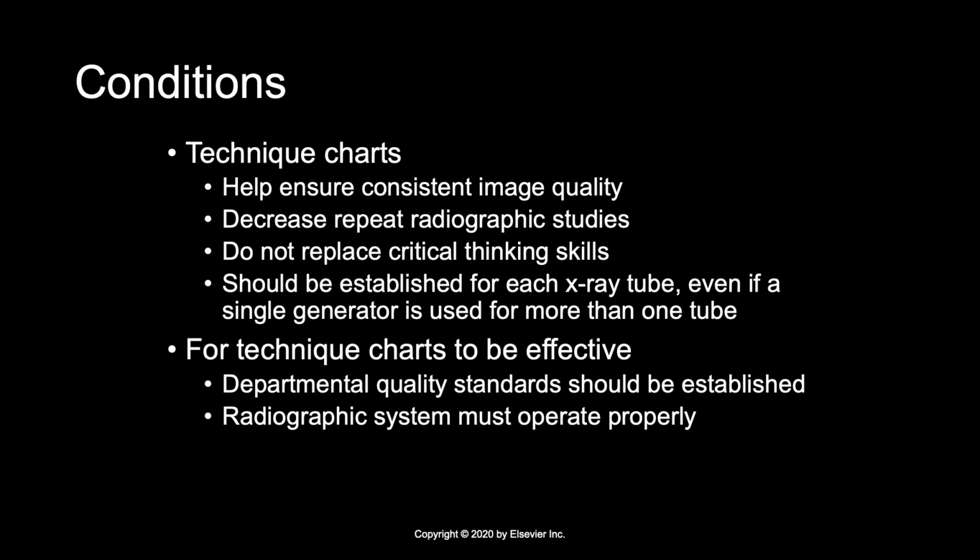When technique charts are developed or designed, they are usually designed for the average or typical patient, and they don't account for unusual circumstances. So patients, in terms of their body habitus, their physical condition, the presence of a pathological condition, this will require us to alter the exposure factors. So these atypical conditions will require accurate patient assessment and then appropriate adjustment of the exposure techniques by the radiographer.